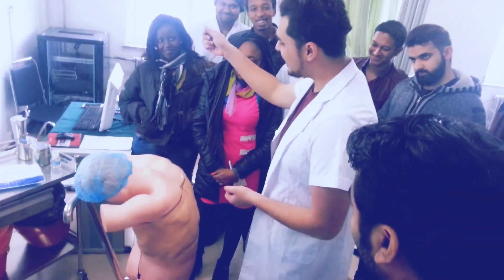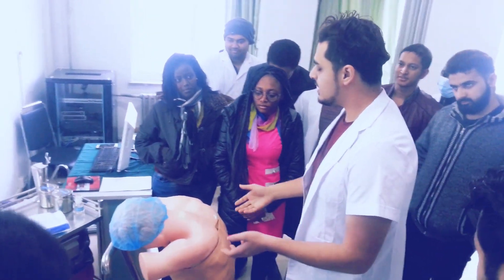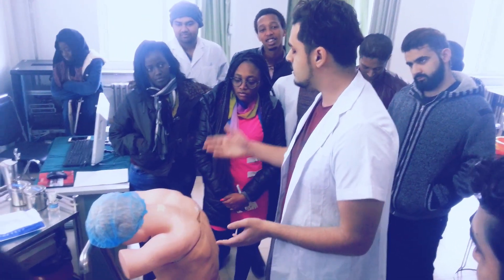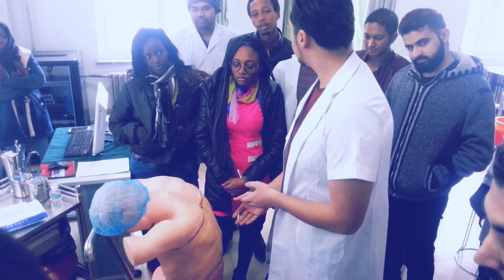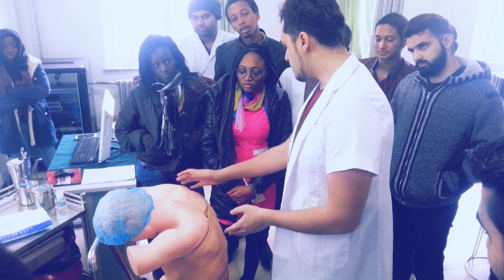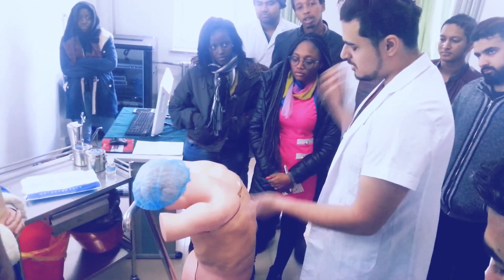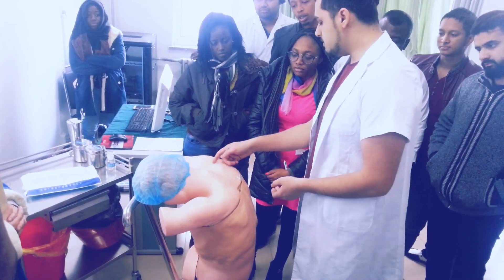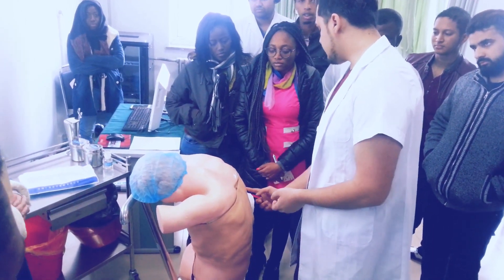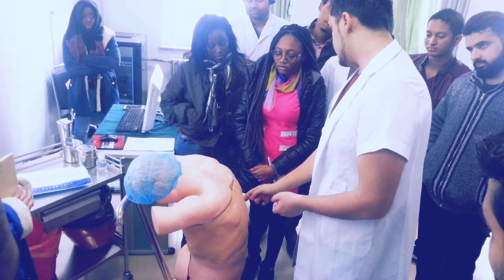It's an imaginary one. From the CT, I can see the patient has a pleural effusion on his right side. Then we will proceed with auscultation to see which point we can drain the fluid from. Mostly the mark is in the mid-scapular line along the 6th or 7th intercostal space — mostly this point.